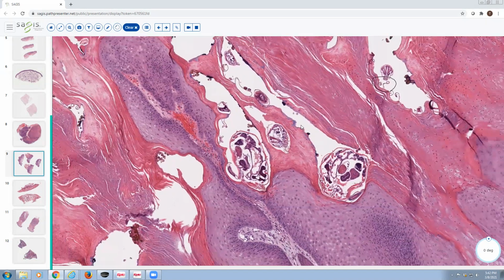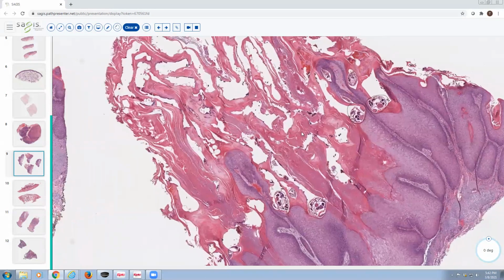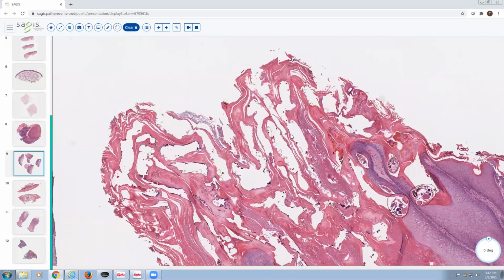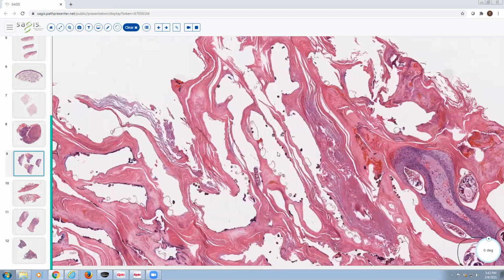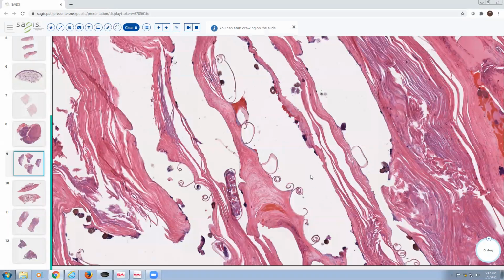Micronodularis features. So crusted scabies, patients have thousands of mites on them at any one time, and it creates this hyperkeratosis that's extreme. And so here's another example of some of those nice pigtails or spirals that are typical of scabies.